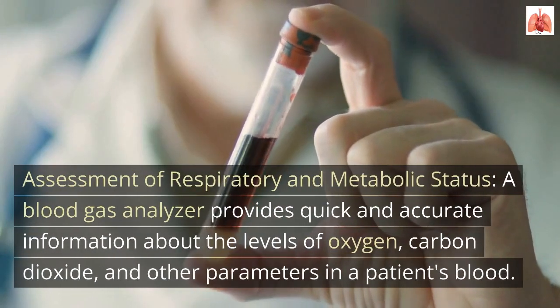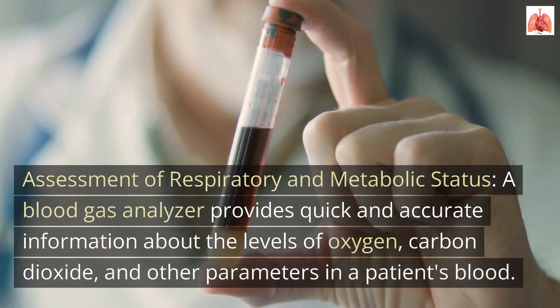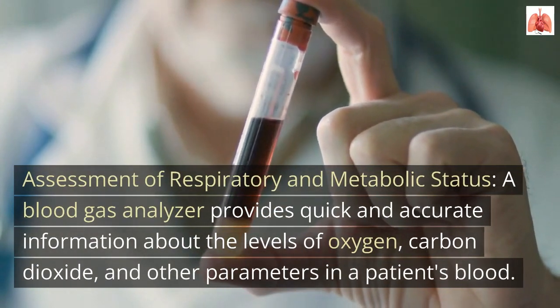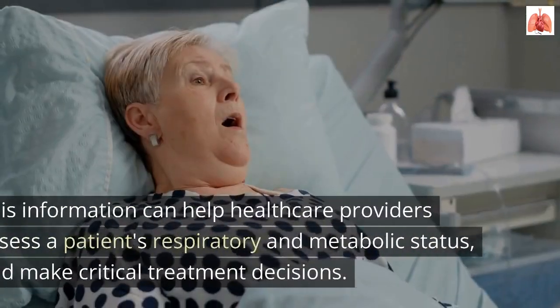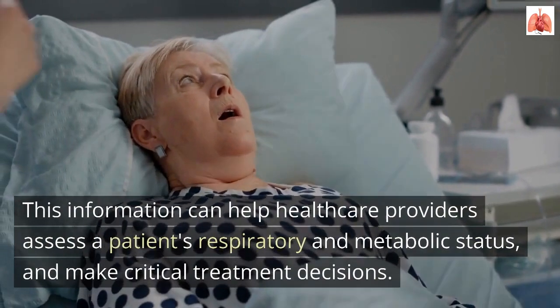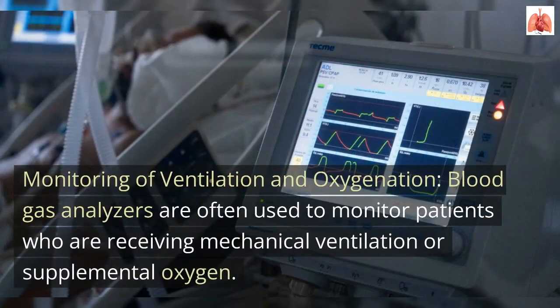Assessment of respiratory and metabolic status. A blood gas analyzer provides quick and accurate information about the levels of oxygen, carbon dioxide, and other parameters in a patient's blood. This information can help healthcare providers assess a patient's respiratory and metabolic status, and make critical treatment decisions.